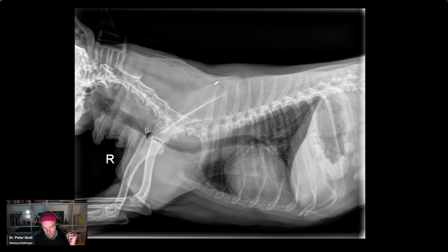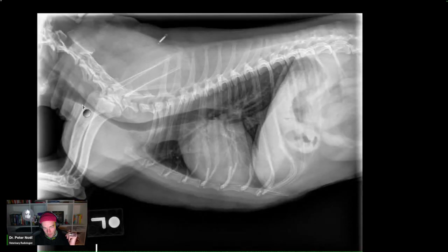I've seen cases where you've got brachycephalic airway dogs and they're breathing against the closed nares and glottis, and that negative intrathoracic pressure will cause that membrane to dip in a little bit more than maybe it would otherwise. And so now you're playing the game of, has it dipped in too much? And I think that's where you maybe have to be a little bit careful. And so this one is pretty invaginated. I mean, that goes down pretty deeply.